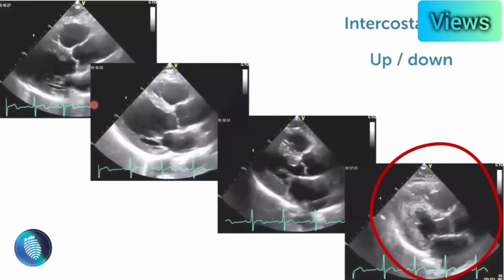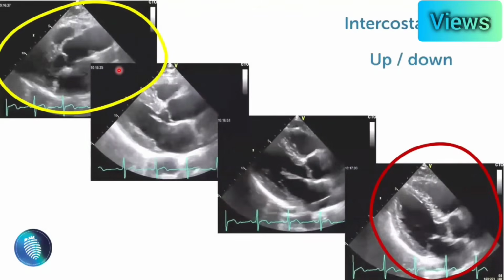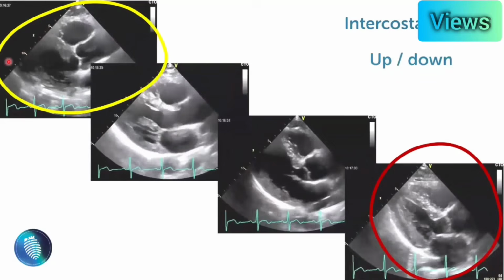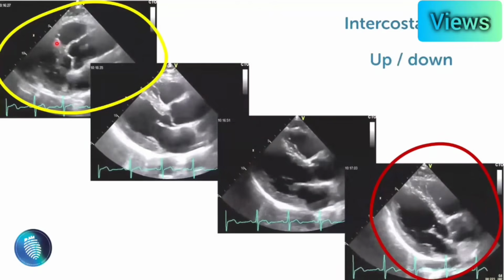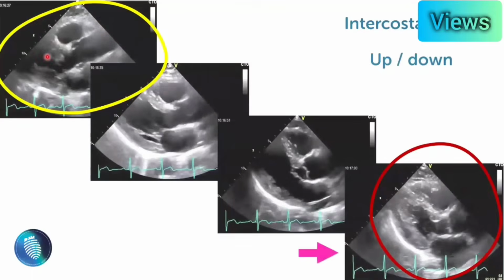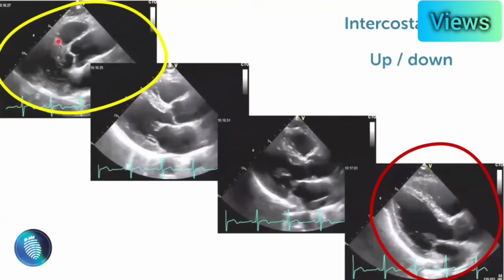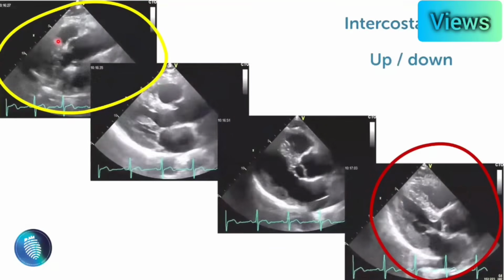While this view is the best parasternal view because it has the two criteria for the optimum view. We don't see the apex and the septum is transverse. If we apply the M mode here for linear dimension of the LV, we will have a perpendicular line cutting the septum and cutting the cavity. So we'll have the best measurement and we will not overestimate the measurements.